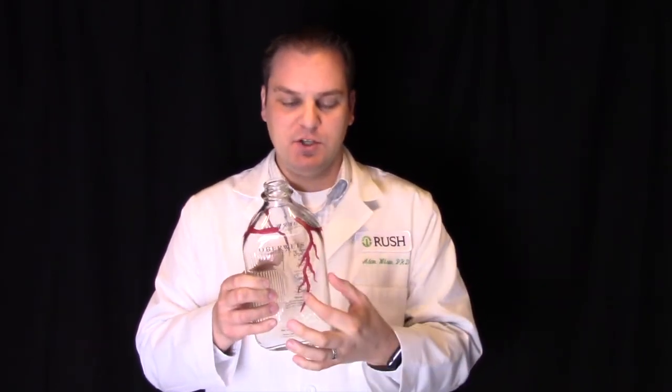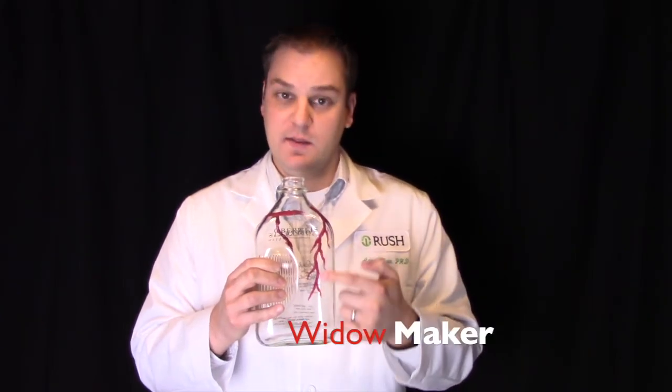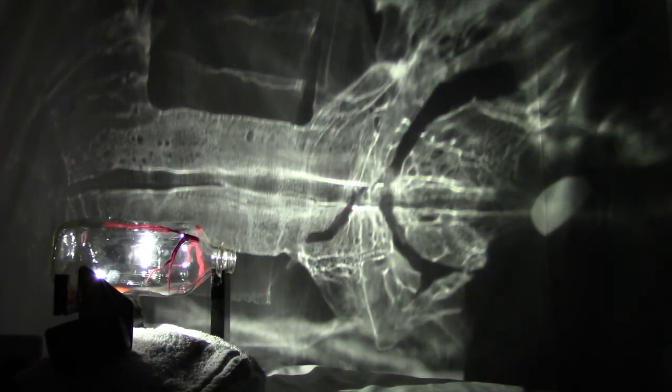Here is the left coronary artery and its two branches. This branch anteriorly positioned is the left interventricular artery, also known as the LAD, which stands for the left anterior descending artery. This is the widowmaker. Along the lateral periphery of the heart is the circumflex artery. For the purposes of this demonstration, my X-ray source is a flashlight.